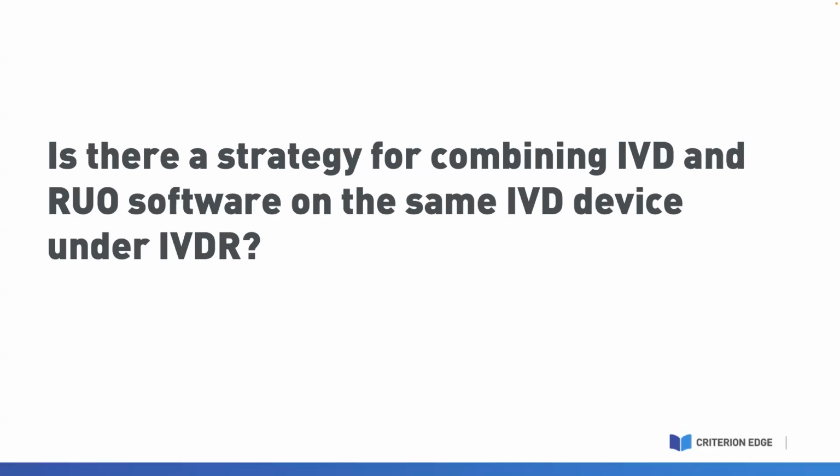But your IVD could have effects on your labeling. So you want to make sure that the software functionality in your IVD is really clearly defined: what's the software's function and the software's role in the IVD versus the RUO.